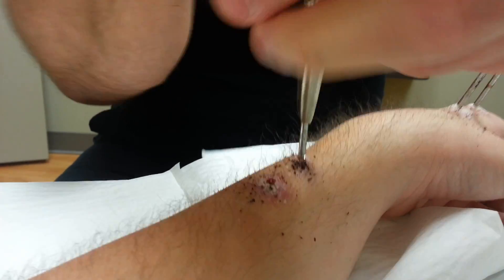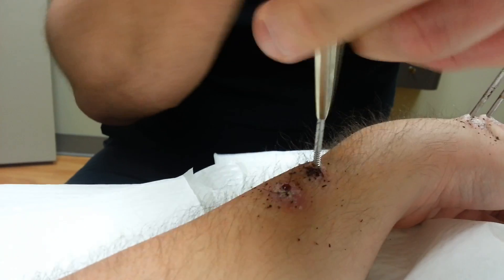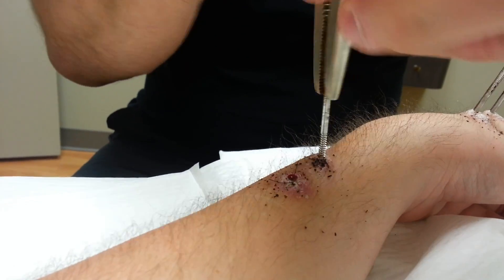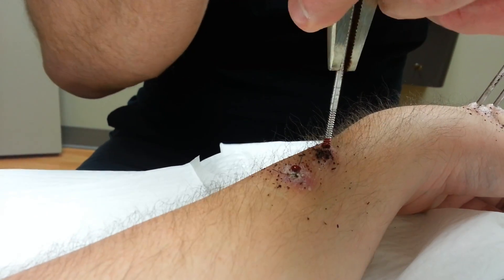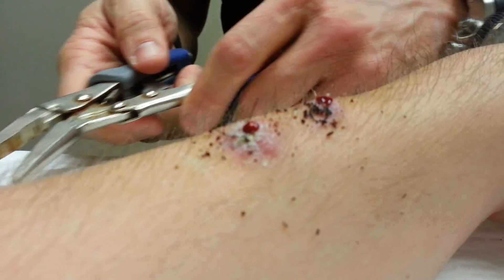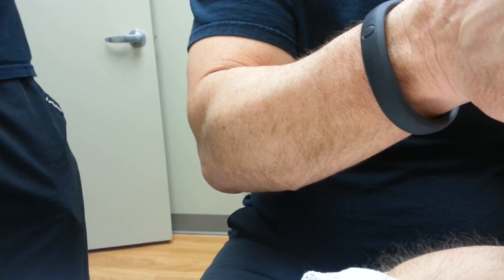Now I have a question. I was watching a video on YouTube last night and this girl had the exact same thing that I have. The only difference is she had this little green ball with like a rod just stuffed into her, basically stuffed all the way down there. And in the video, the doctor did the exact same thing you're doing, but when he pulled hers out, it wasn't screwed in — he basically just pulled it right out.